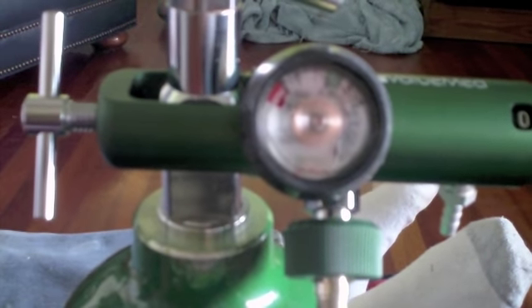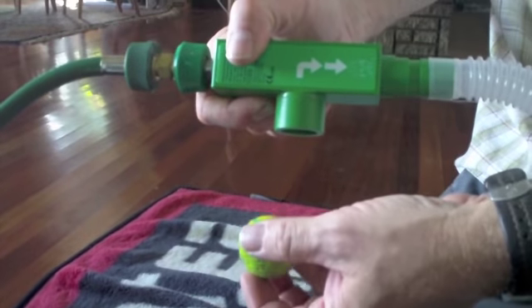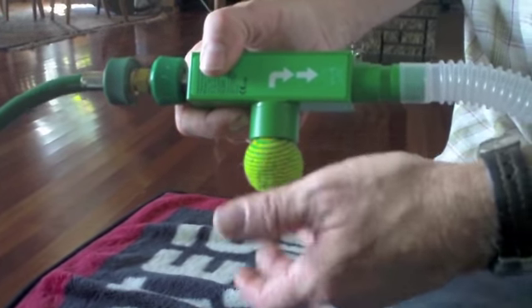Make sure that the oxygen valve is turned on completely. Check that there are no air leaks around the mask. Tighten the straps as needed to complete the seal. This demonstrates air being released from the CPAP valve and suction at the CPAP generator.